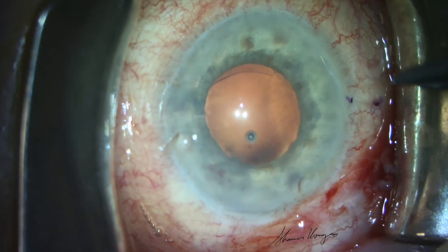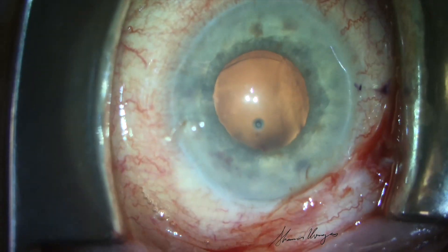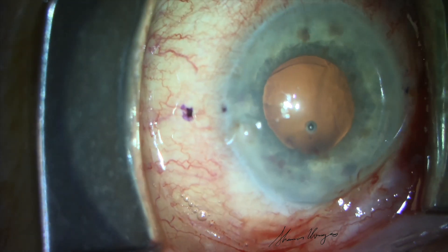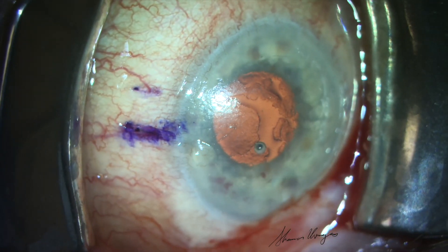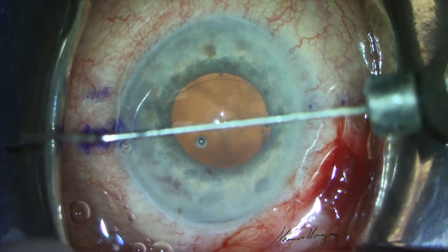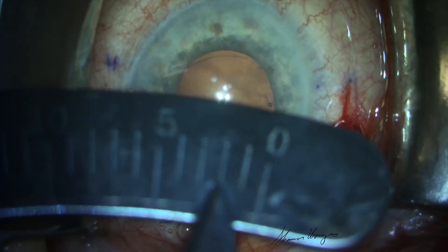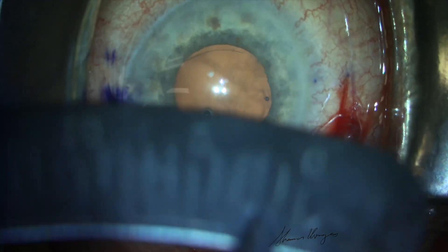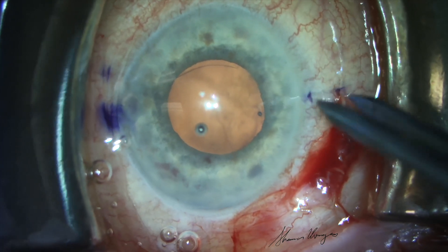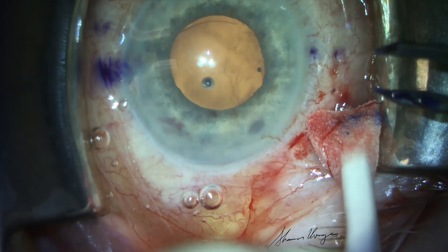Calipers are used to mark the 3 and 9 o'clock areas, 2.0 millimeters posterior to the limbus. A 27-gauge cannula is used to verify that the marks are 180 degrees apart. We also mark 2 millimeters above and below our marks to guide placement of the 30-gauge thin-walled needle.